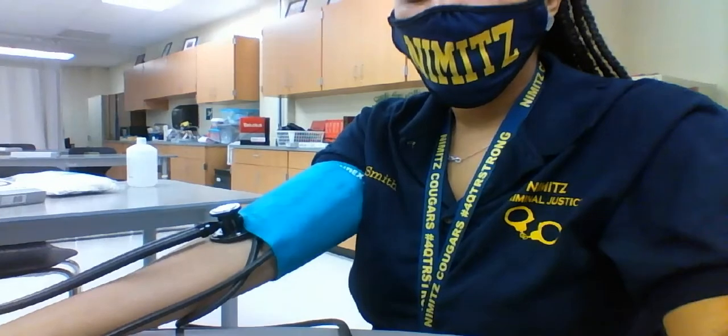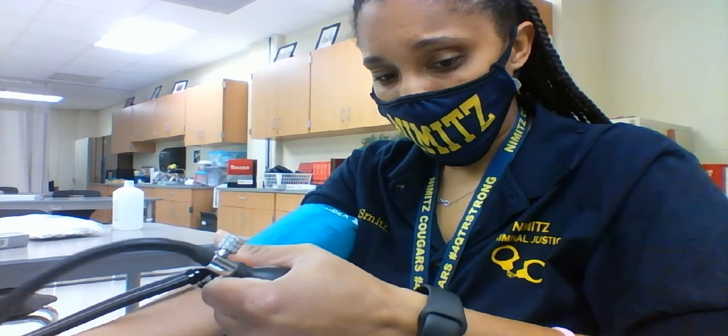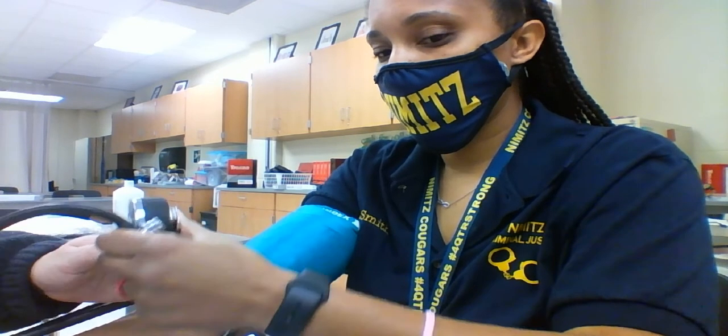Now I'm only doing this because I'm showing you how to do blood pressure. But in reality, you would do this yourself. So we're going to pump it up. Here, hold this so they can see it. That way. Okay, yeah. We're going to pump it up, pump it up, pump it up. Now you want to get up to about 160, 200, sometimes 160, 180. But you want to do it really, really fast, but consistent.